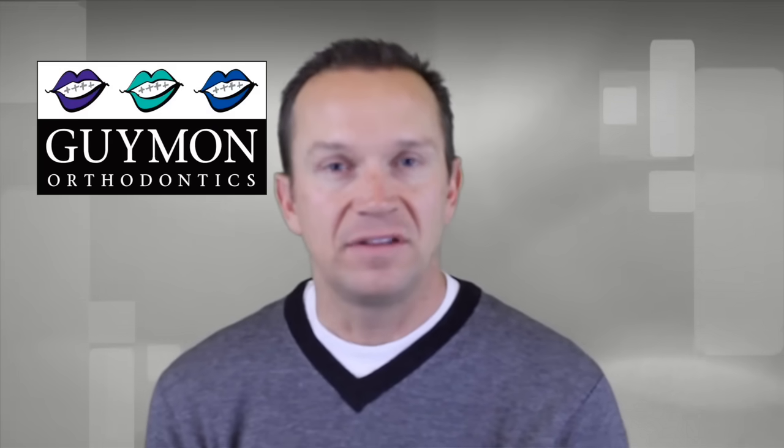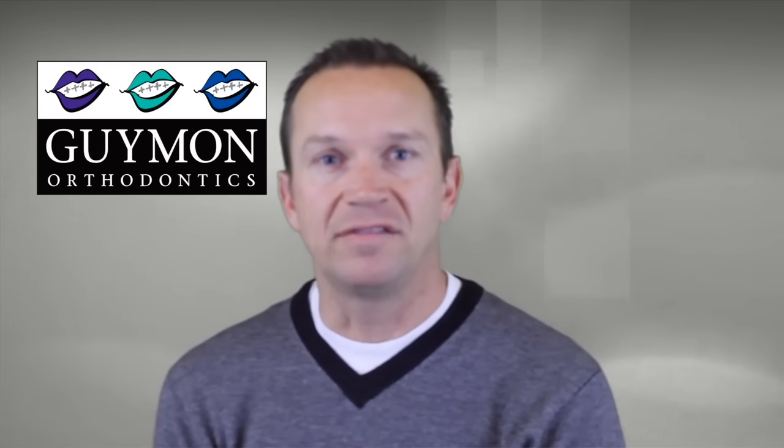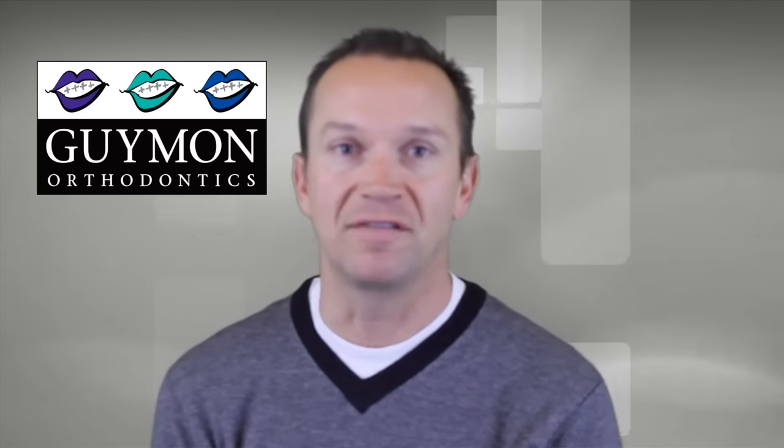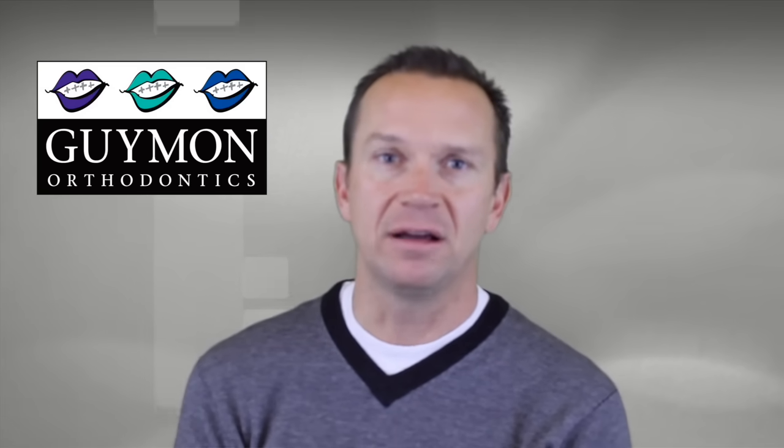Okay, so there you go. You just saw us give you a little clip of what it was like getting the braces on. Now, obviously that was a shortened version of the reality of it. From start to finish, it probably takes us about an hour to put on braces and get everything done. So it's a little longer than what you saw there, but we're not working on the patient the whole time. So you're not sitting there with your mouth open and your cheeks stretched out for the whole hour, but it does take about an hour to get the whole thing done.